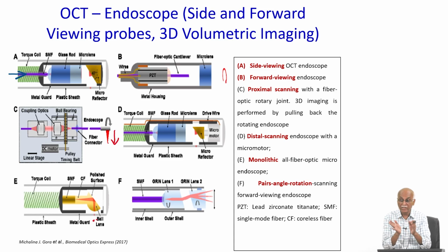Before the light diverges, it is coupled with the GRIN lens, a gradient index lens, whose refractive index gradually changes, which allows the light to become collimated. Every wavelength and every such size will have a particular gradient configuration.